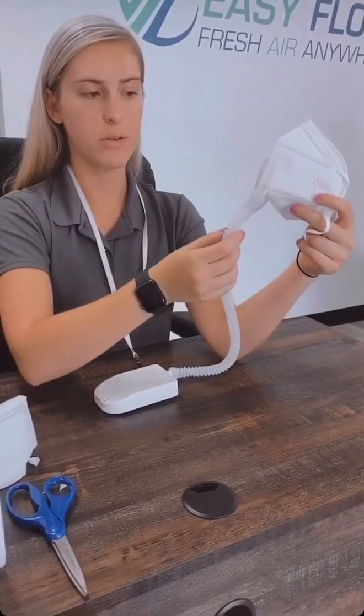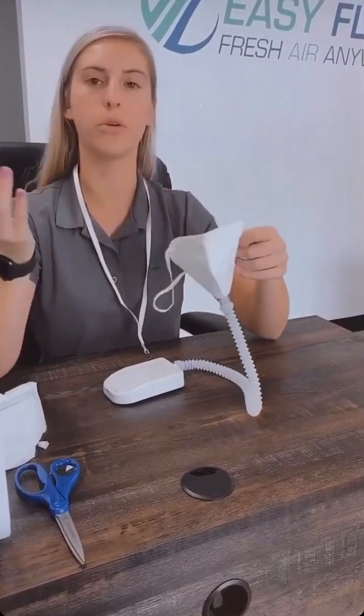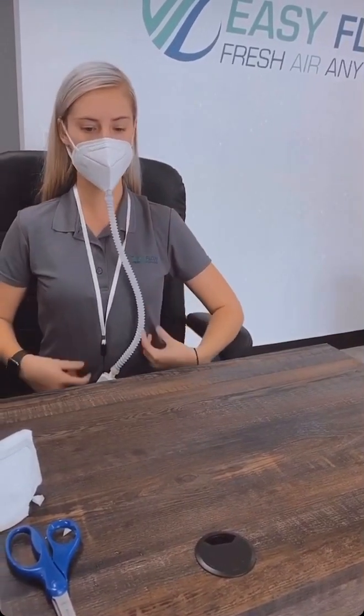Now once I have the hose connected to my mask, I can put on the device. I like wearing it with the lanyard when I go to the grocery store or whatever it may be. Put on the mask. Nothing pulls on it. Everything stays in place. And now you're ready to go.